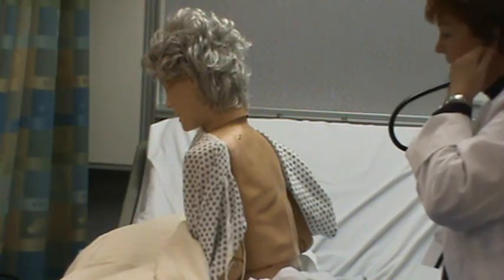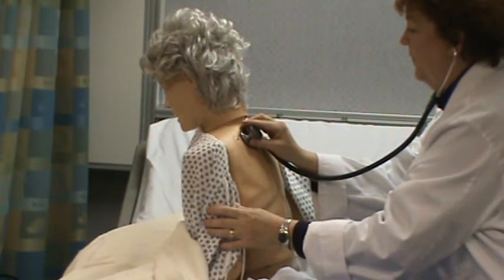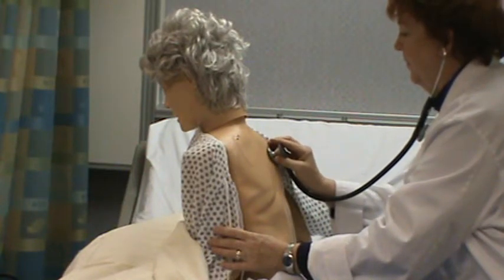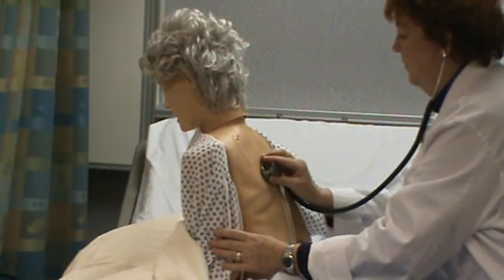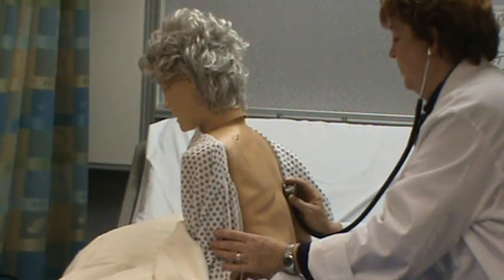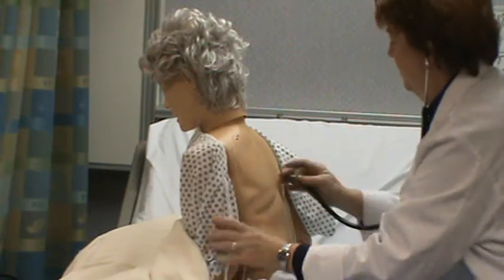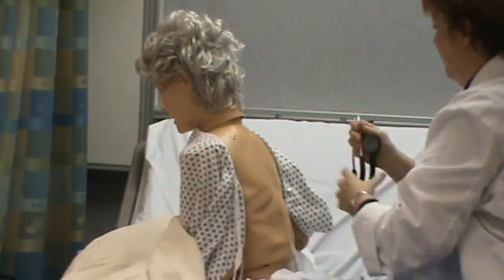I'm going to auscultate and ask her to breathe in and out each time I move the stethoscope. Her lungs are clear to auscultation.